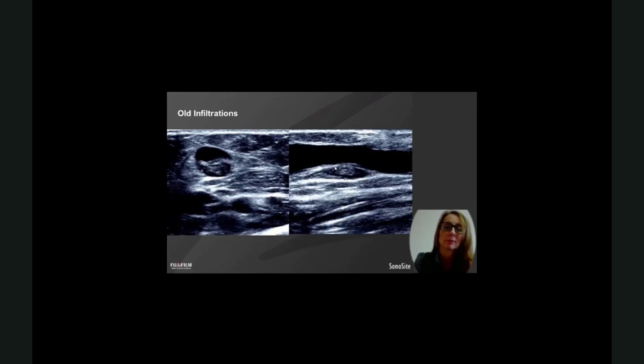So having the ultrasound from the start would help us to decide to probably go over here instead and avoid that, or use good tourniquet and puncture here and then be able to watch ourselves thread through this lumen and out to the other side. So that really does minimise the impact, because if we continue to puncture there and re-puncture that back wall, that would set us up for failure for many, many, many weeks.